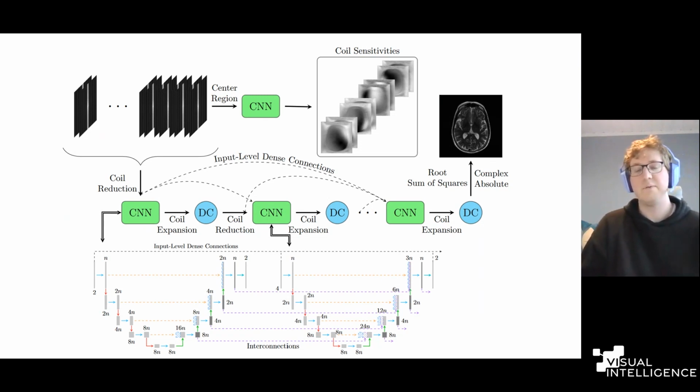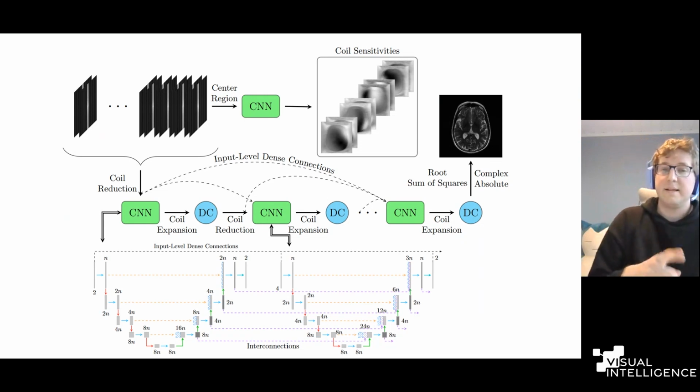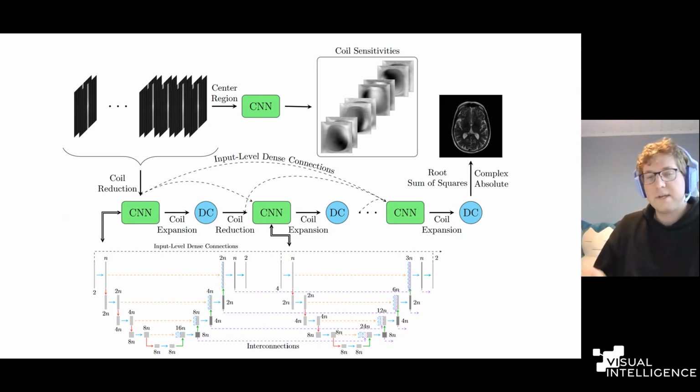You already know a part of the ground truth, so you enforce this form of prior knowledge into the model. And then you can continue with this form of refinement over and over in an iterative process. So commonly you use like 12 iterations, 20 iterations to do this. And the final output is the magnitude image.